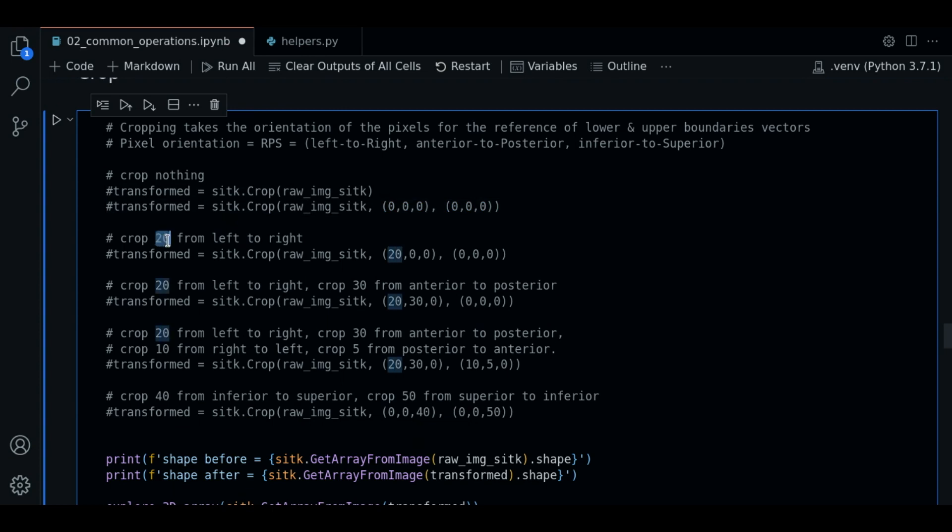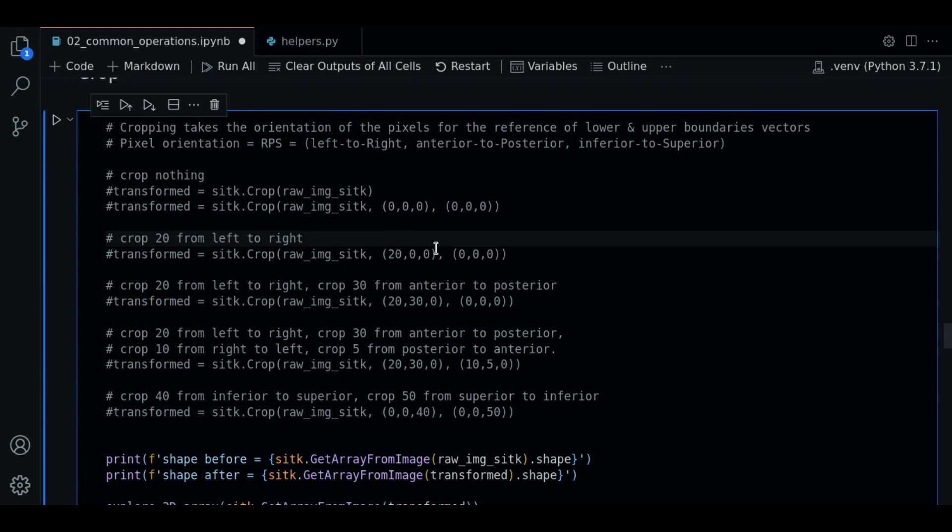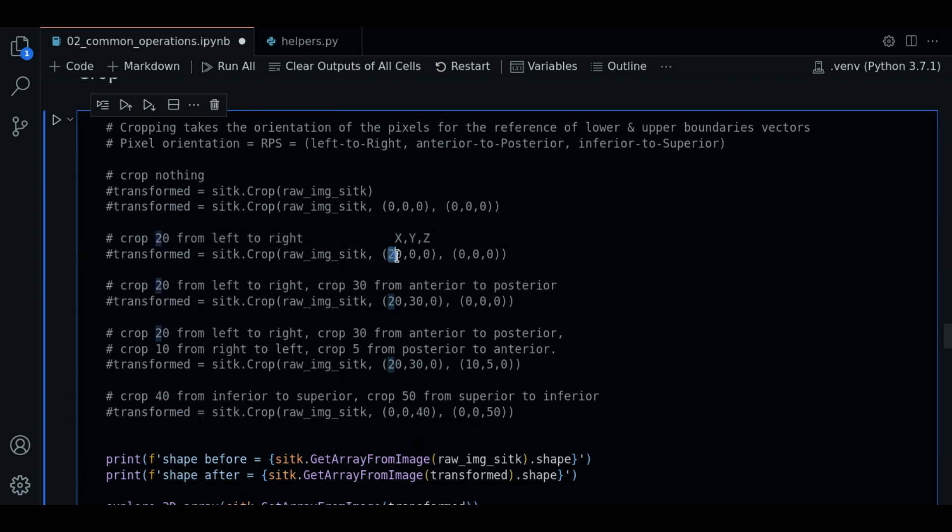Let's say now we want to crop 20 units from left to right. In order to do that remember that the internal orientation for sitk has the order of x, y, and z. If we want to crop 20 units from left to right we place 20 units in this tuple that is the lower boundary vector.